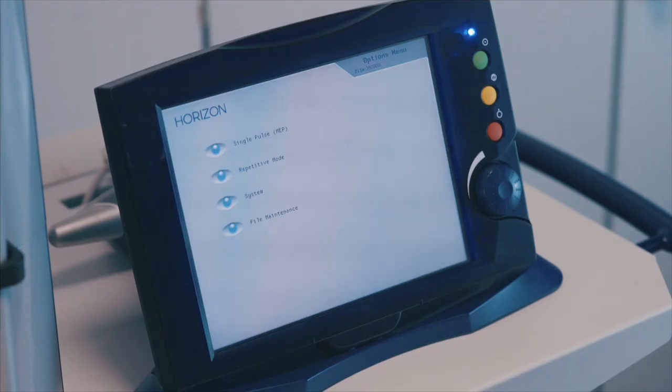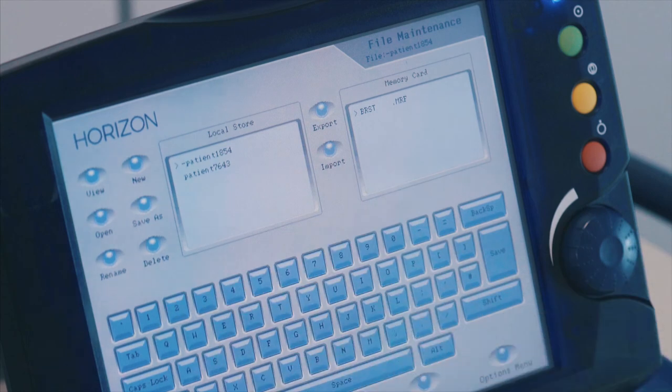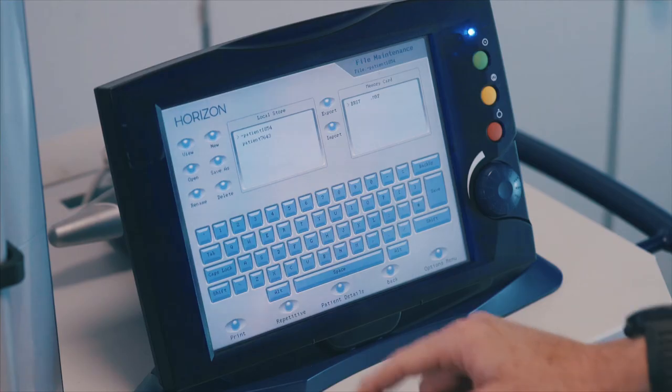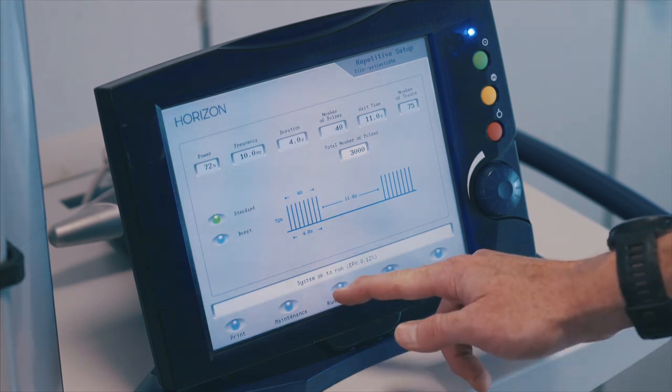To recall a saved protocol, from the options menu select file maintenance. Select the file using the control dial and press view. The file name should be shown in the top right corner of the screen. Press the repetitive button — your protocol should be set on the screen. Press the run session button to proceed to treatment.